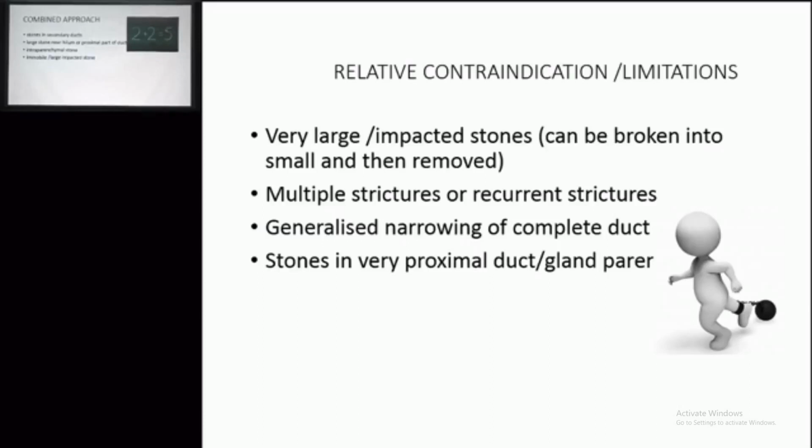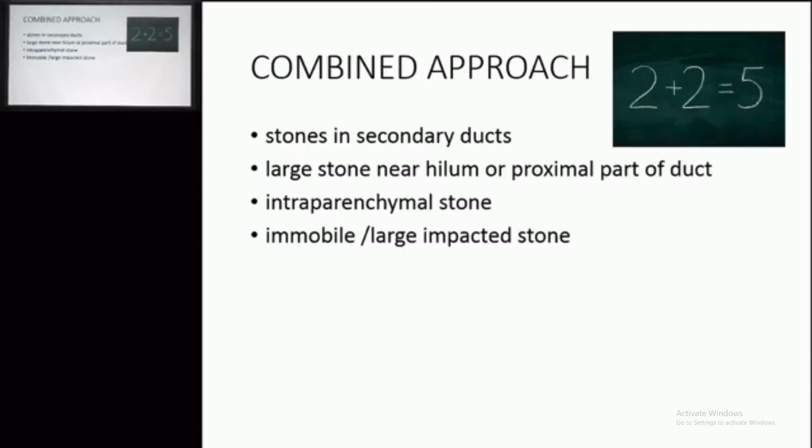One very common thing that happens is a temporary swelling, because we saw how we are irrigating the duct, and at that time you can land up with a temporary swelling which will just settle down with anti-inflammatories and a little massage. If the mouth has to be kept open for long, sometimes these patients can get a TM joint strain, and occasionally you can land up with a perforation of the duct wall, but if identified in time, then it's not a major complication.